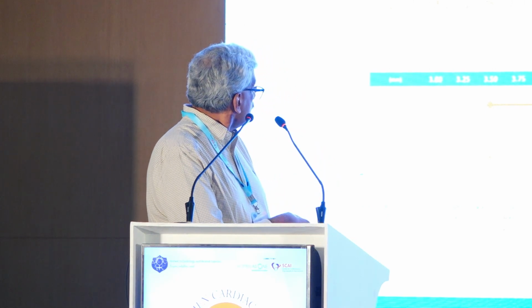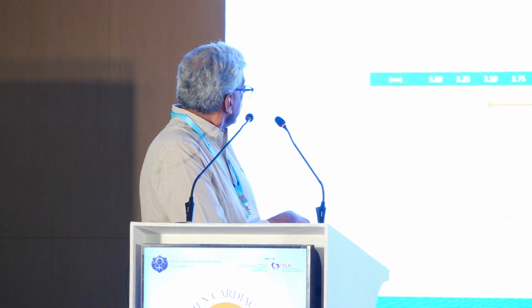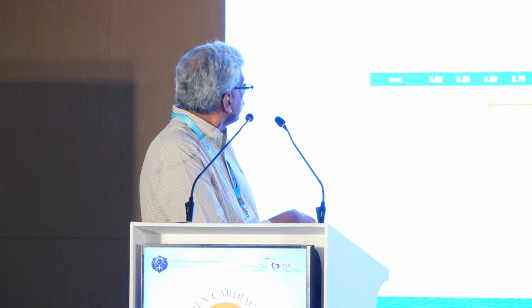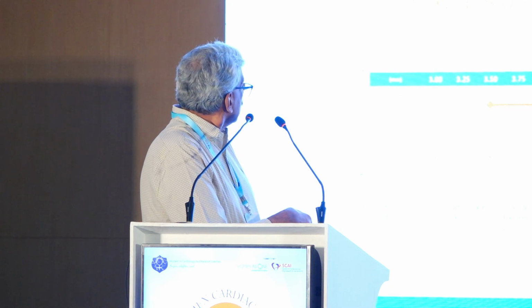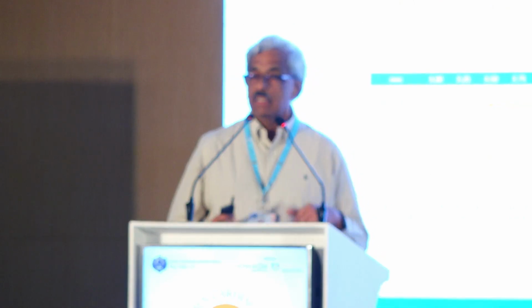You saw the Synergy being used in the last case. I had a push of a 3.5, I could push it to 4.25, a little bit of push, I can get 4.5. With a Megatron, a 3.5 easily goes to 5, and with some push, I can get it to 6. So if I have a really roomy left main, I can't put the Synergy, because the Synergy will go only up to 5. And if you try to push it up to 6, you're going to break the strut, and you're going to get a deformation, which is a problem.